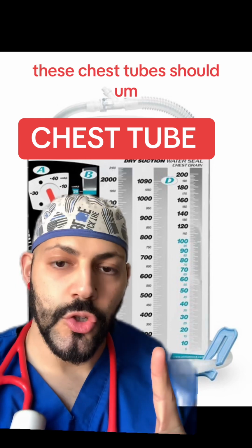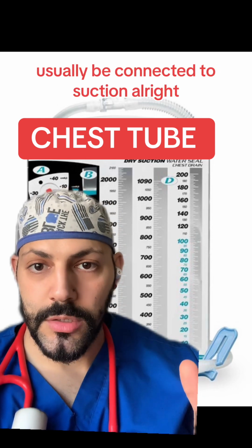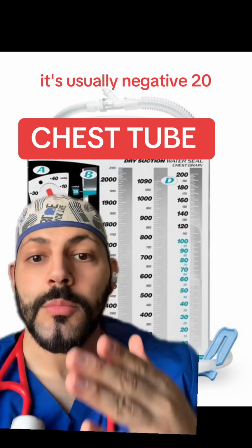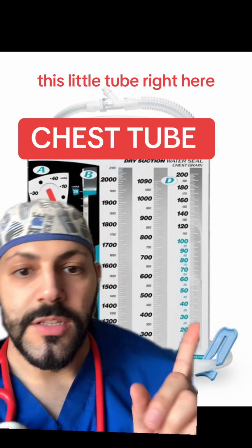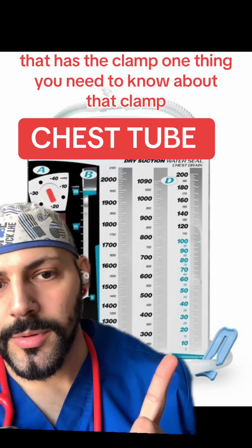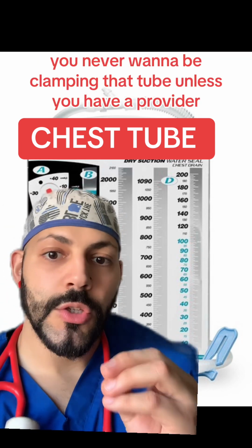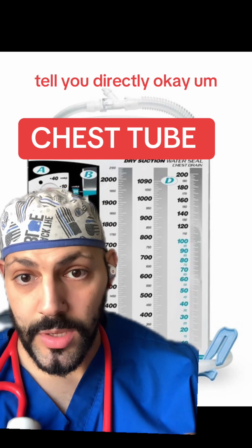Now, these chest tubes should usually be connected to suctioning, all right? And that's where the setting is going to be. It's usually -20, but you'll see in the order exactly what it needs to be set at, okay? This little tube right here that has the clamp, one thing you need to know about that clamp, you never want to be clamping that tube unless you have a provider tell you directly, okay?